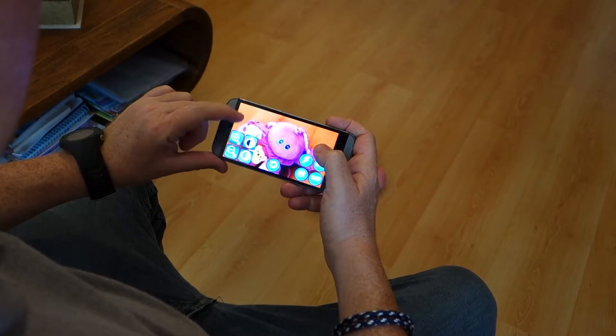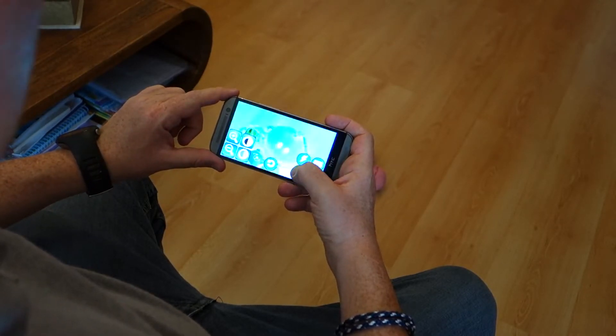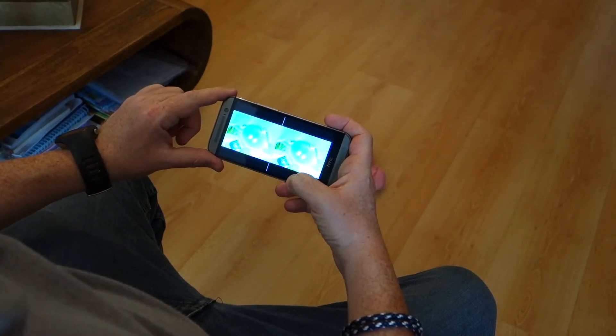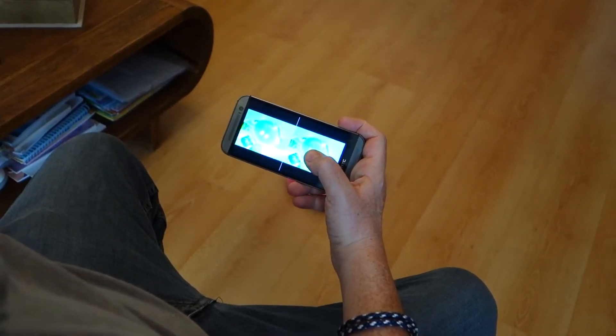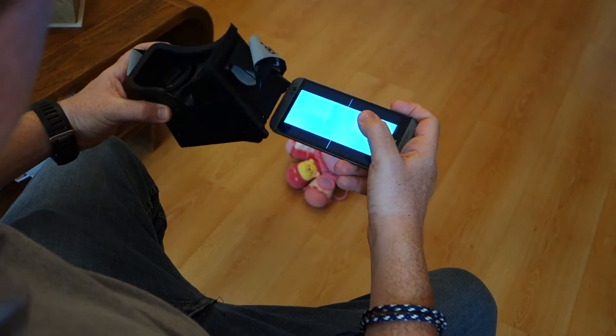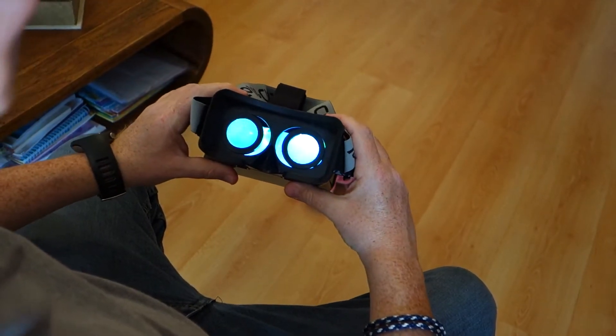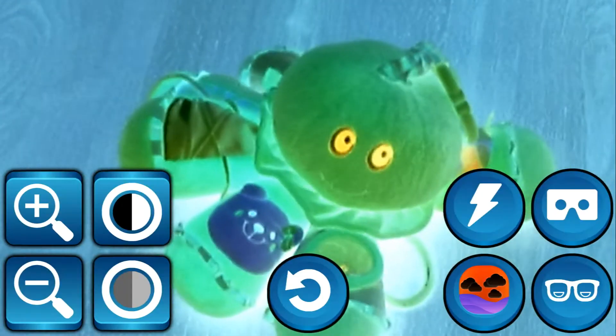The key feature of SuperVision is the integration with Google Cardboard. This inexpensive device and our software transform your smartphone into electronic glasses. This feature provides a really impressive experience to the visually impaired user, improving many day-to-day tasks like watching TV or reading a book.